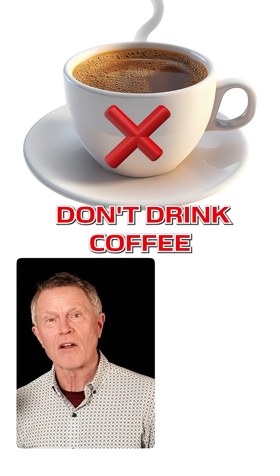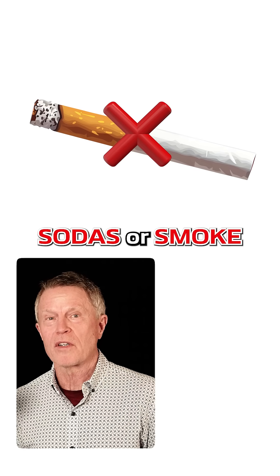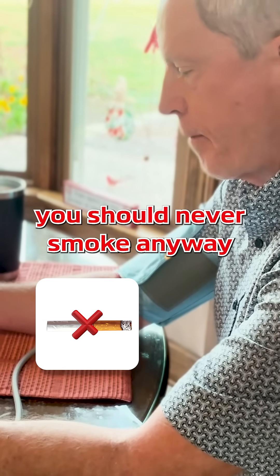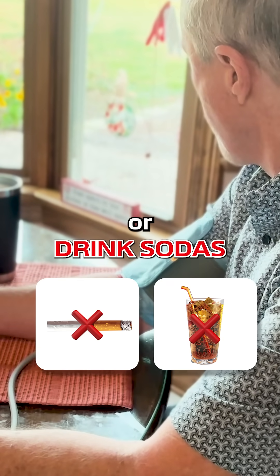Number one, make sure you don't drink coffee, sodas, or smoke for at least 30 minutes before doing the test. And in fact, you should never smoke anyway. Or drink sodas.